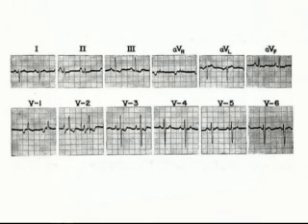Now, this is an example of right ventricular hypertrophy. Start with, what's the mean electrical axis? Normal or abnormal? Abnormal, and we're net negative in lead 1, so we're automatically thinking right axis deviation. Then we go to aVF, it's net positive, right lower quadrant. Find our isoelectric lead. aVR is net positive even, so we go find in lead 2 it's isoelectric, so we have an axis of 150 degrees.